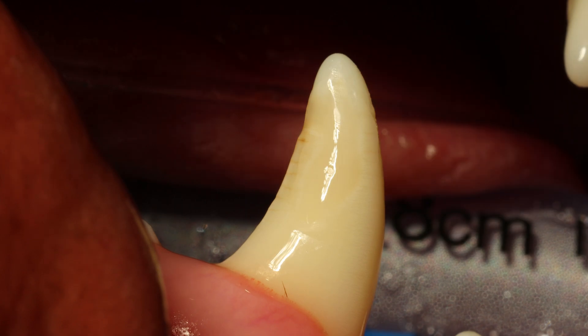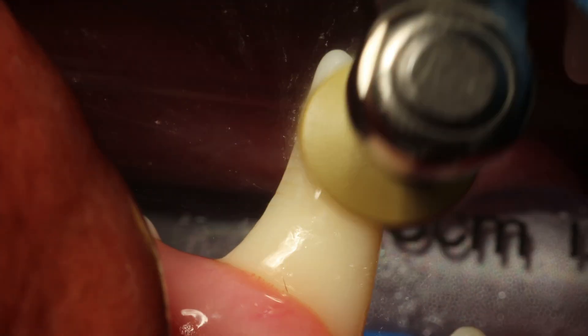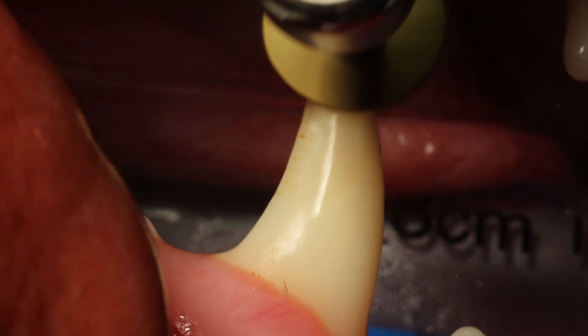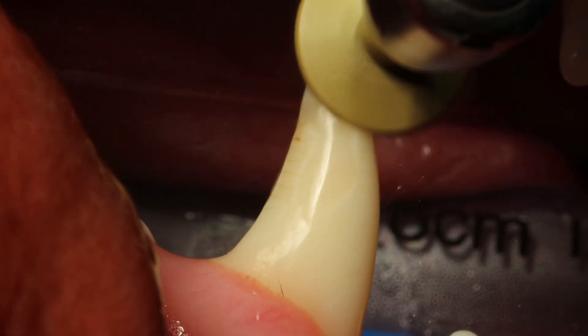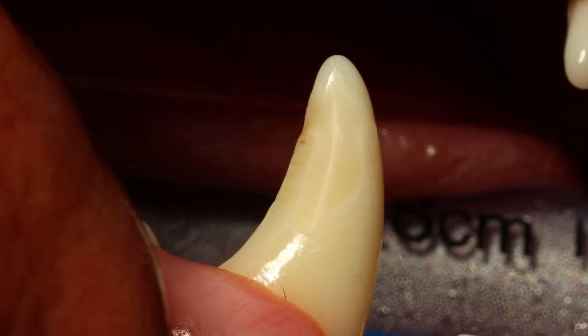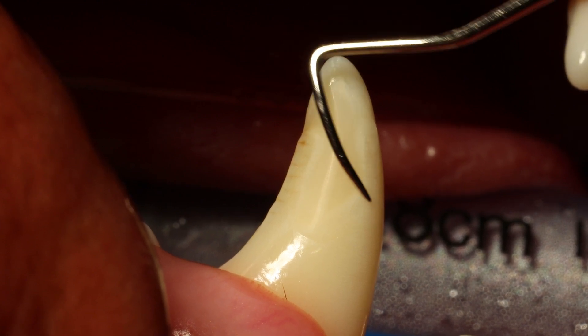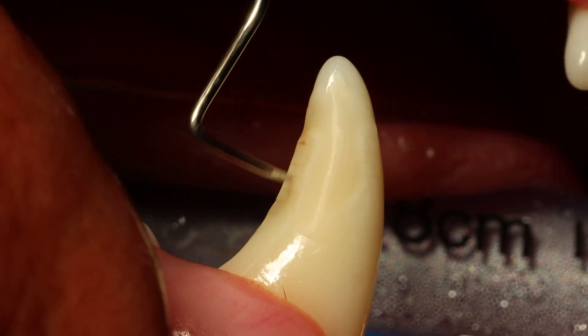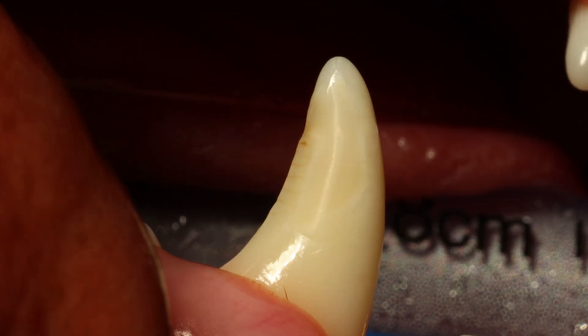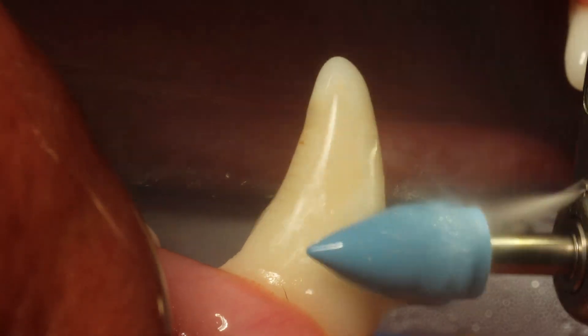Now I switch to a polishing rubber — a flat version with a finer grit than the sanding disc used before — just to smooth everything out very nicely. Here is a very important step: you want to make sure there are absolutely no cracks or edges where the restoration meets the tooth. Use a very sharp instrument — in this case I am using a pigtail explorer — to detect any edges that need to be smoothed down further.